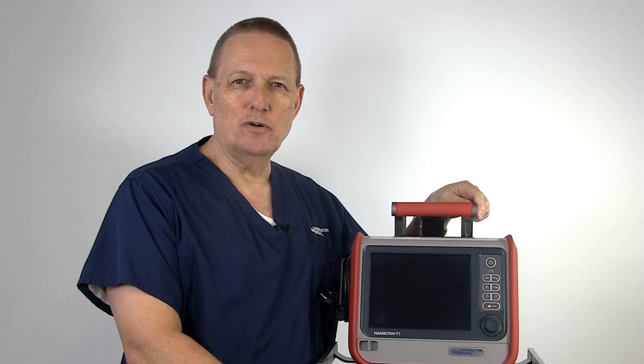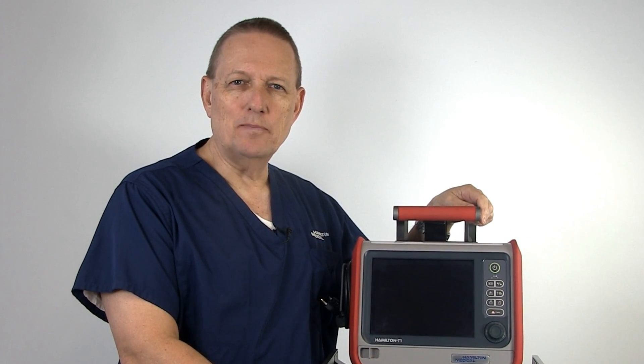Hello, I'm Billy, the Hamilton T1 account manager, and today we want to talk about setting up the Hamilton T1 and how to run the pre-op checks.